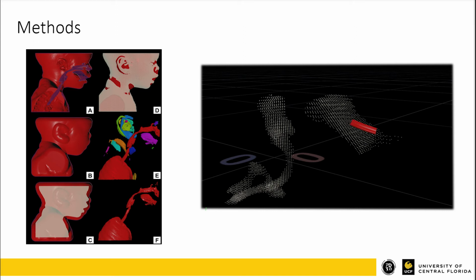An outline of the path from the oral cavity to the epiglottis is produced, which is used to construct the patient-specified 3D printable blade. Using this set of algorithms and procedure allows the segmentation, reconstruction, and creation of the patient's airway and specified blade in a quick, automated way.